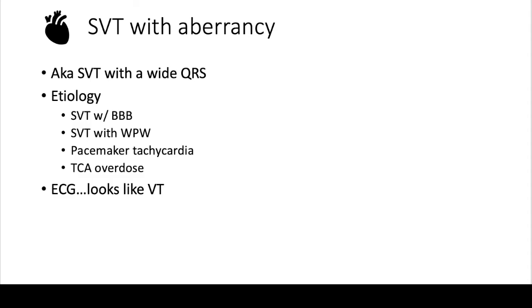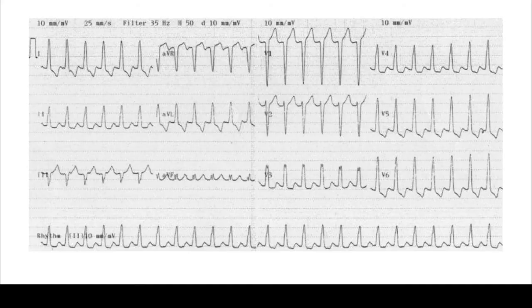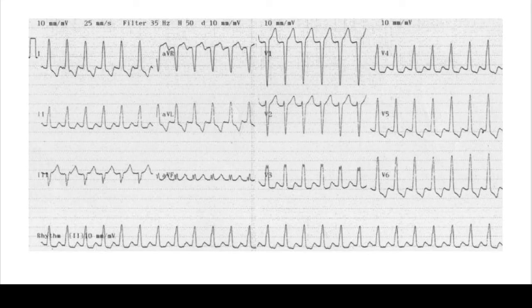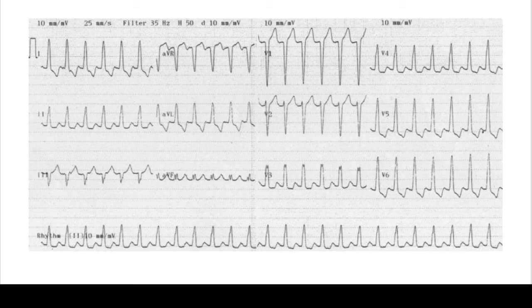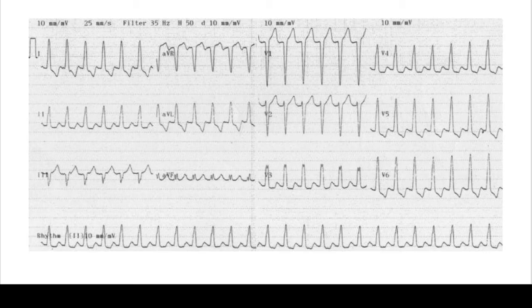The key thing here is that these EKGs look exactly like VTAC, and you want to treat them like that too, which we'll talk about in a sec. But first, let's look at these examples. Here we have this wide complex tachycardia beating at about 150 beats per minute, and this was actually an SVT with a left bundle branch block.